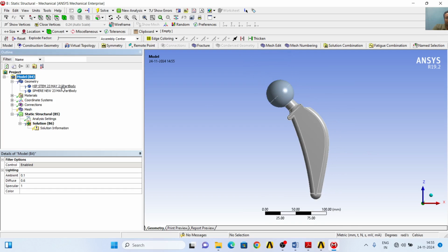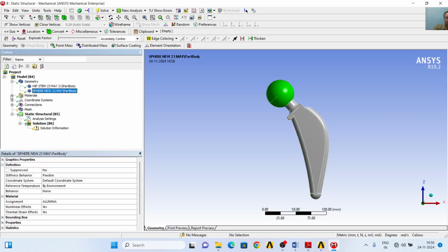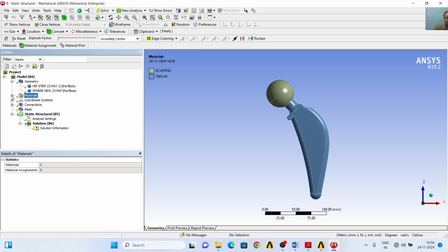I will now define the material properties here, and I will assign the hip stem the material titanium 6Al-4V and the sphere head the alumina material. Okay, so the geometry has been defined, and now I will go to materials. There are materials for viewing the mechanical properties of different materials, and I will minimize the step.